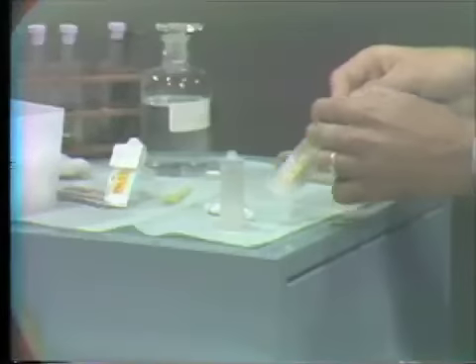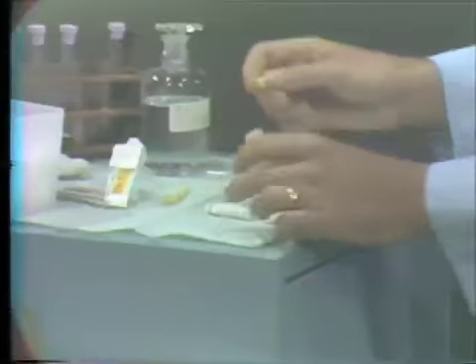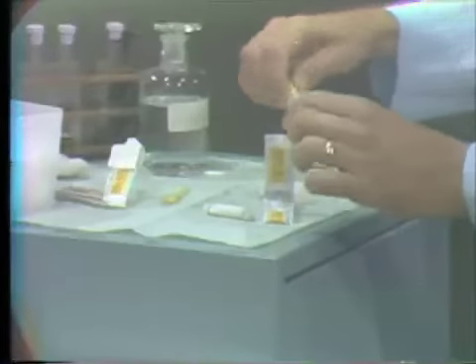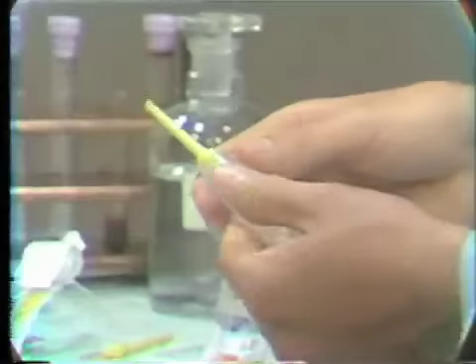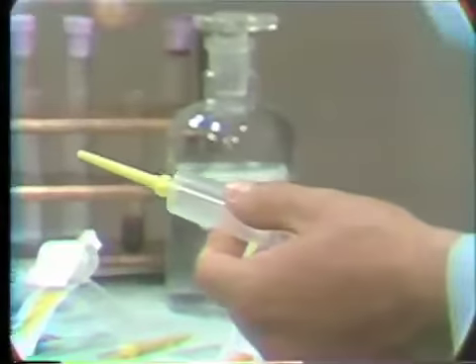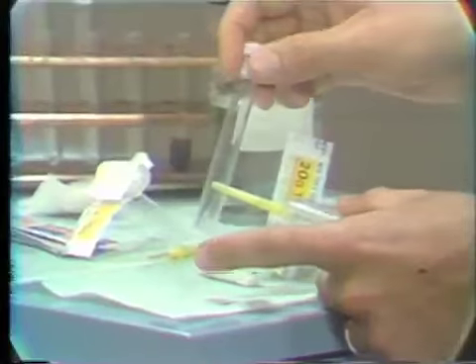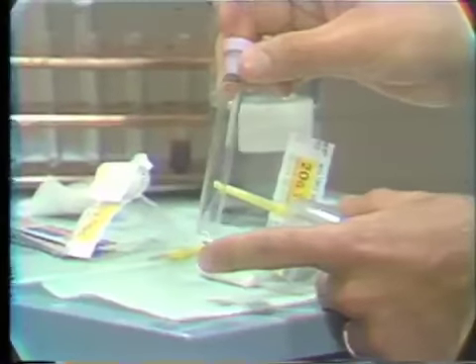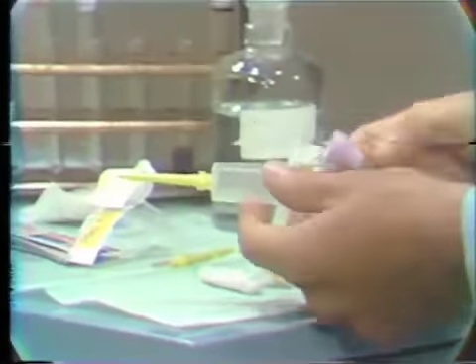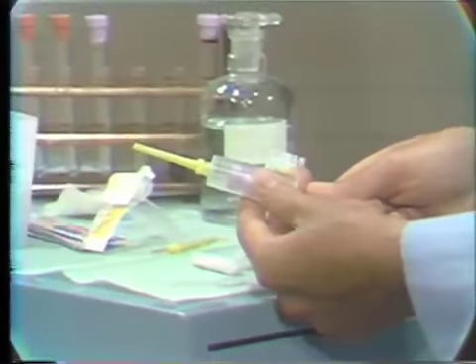Applying the Vacutainer needle to the Vacutainer holder is just as easy as screwing it right on. There's nothing really to test now as there was with the syringe. A Vacutainer, which is a test tube with an anticoagulant in it and a vacuum that draws in 4.5 cc's of blood, is then placed firmly on the Vacutainer needle.